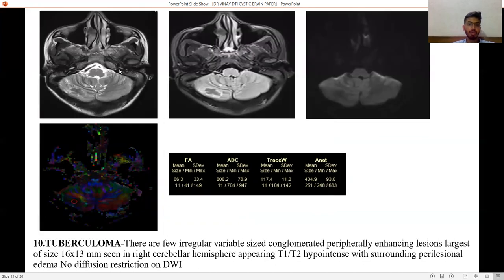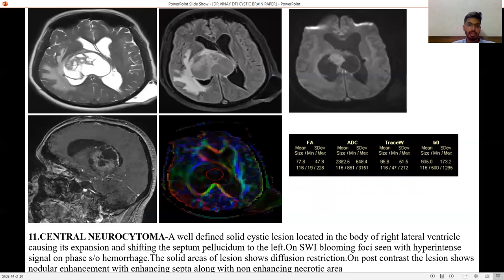Tuberculoma — there are few irregular variable-size conglomerated peripherally enhancing lesions, largest of size 16×13 mm, seen in the right cerebellar hemisphere, appearing T1 and T2 hypointense with surrounding perilesional edema. No diffusion restriction is seen on DWI.